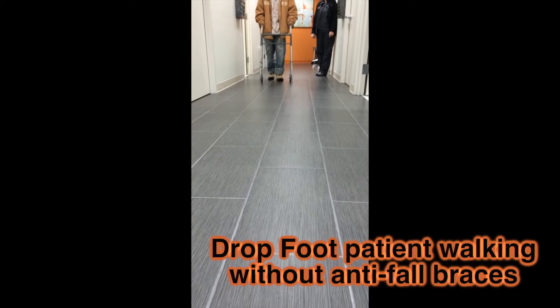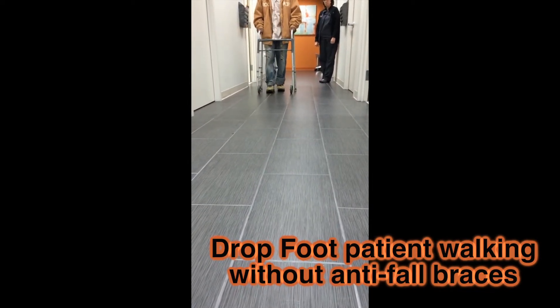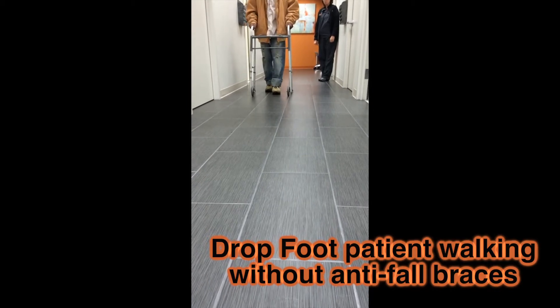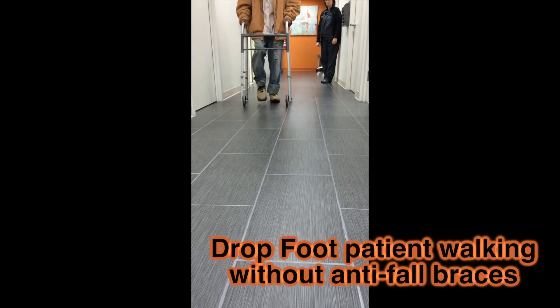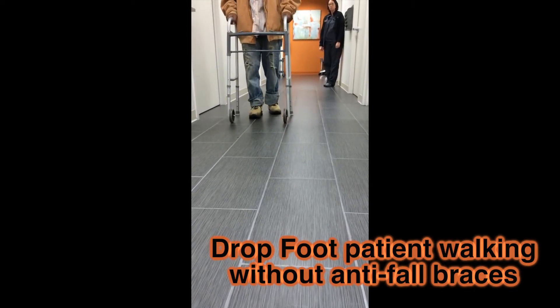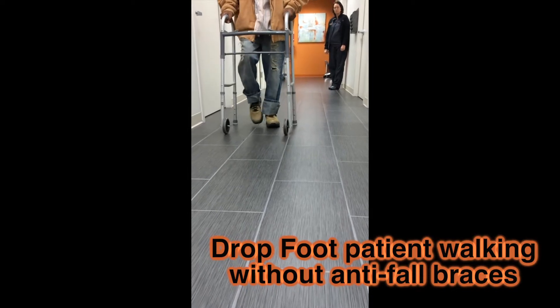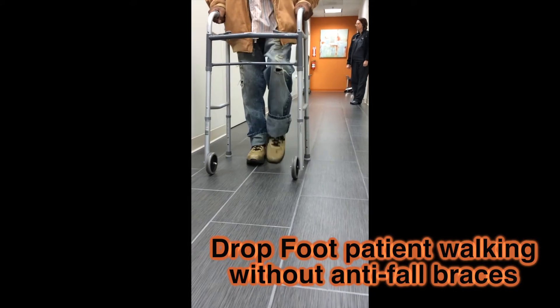This is a patient who has drop foot, and he's walking without his anti-fall braces. I'm going to have you walk all the way towards me, and then we're going to put the braces on. I'm going to do a second video walking with the braces — I'm so excited to see that. You can see that the dorsiflexion is very weak.